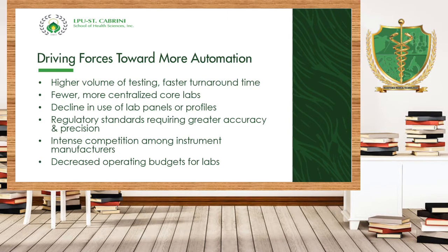At since bumababa na nga yung demand sa laboratory profiles or laboratory test profiles or panels, we must adapt new procedures in order to increase, no? In order to increase the capacity to perform all those tests. And the answer to that is the automation.